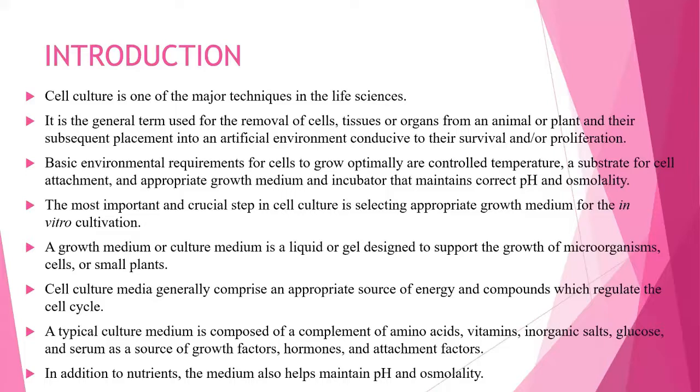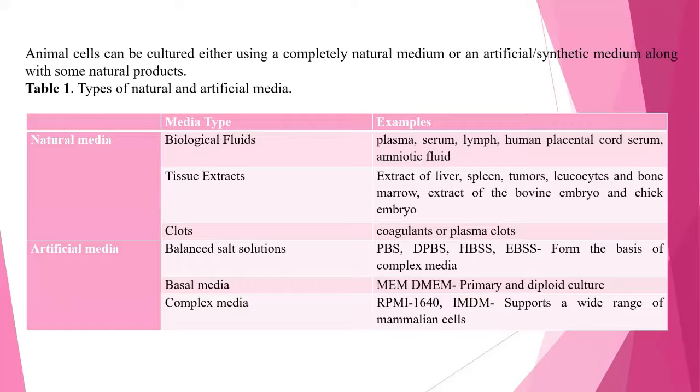pH, osmolality, oxygen supply, carbon dioxide supply is also required. Okay, so please make a note of all these important things that you have to maintain for a cell culture media. So this is, as it is, the types of cell culture media.